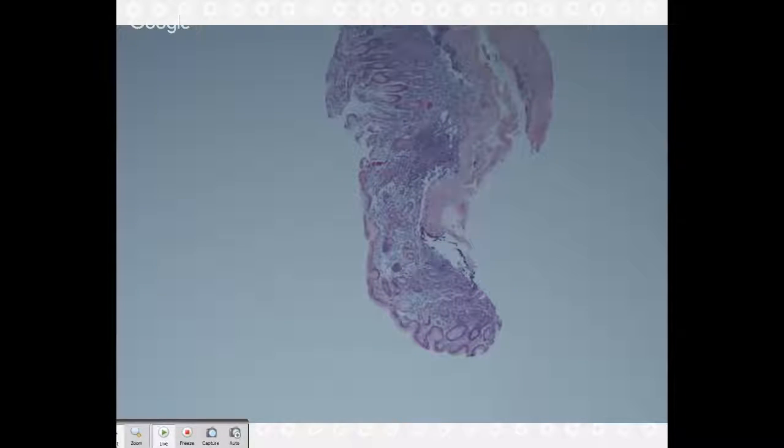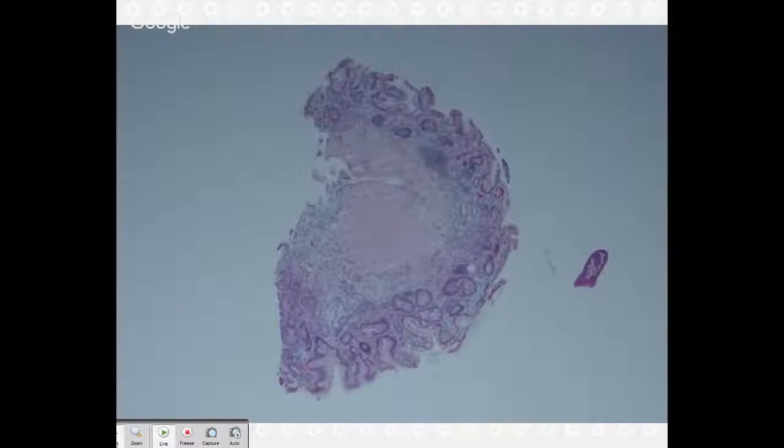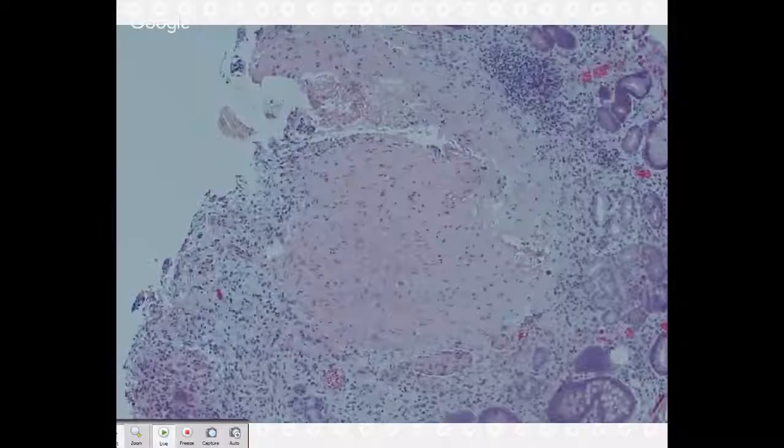Okay, who would like to describe what we have here? We're again in the stomach, yes? I can try. Go for it. So I think it looks like antral mucosa here. It does look like antral mucosa here. It's very busy, and the busyness is more of a patchy thing. At some places it is scattered, somewhere it is localized.